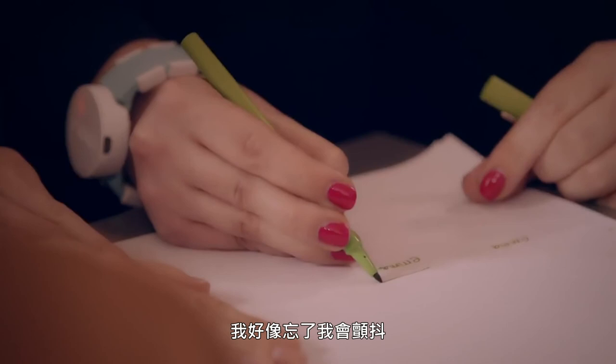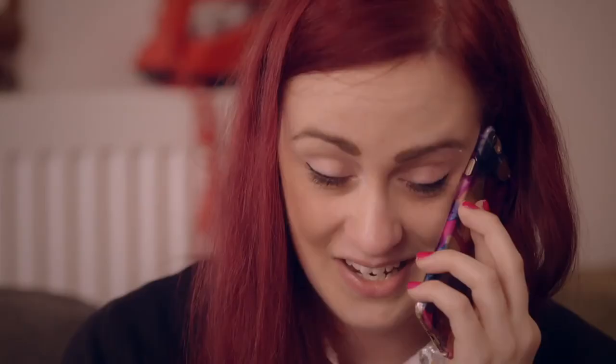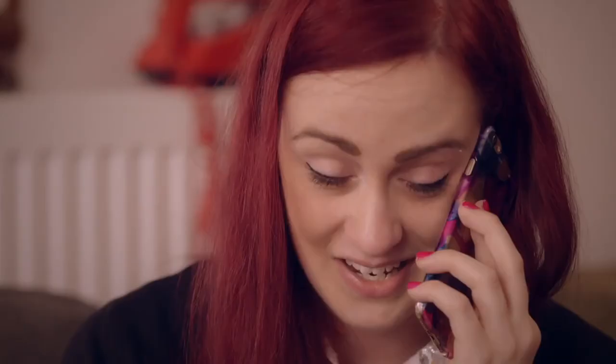Oh my God! It makes me forget that I have a tremor. I haven't drawn one of them for a long time. I've actually just written my name for the first time in ages. I can't believe it.